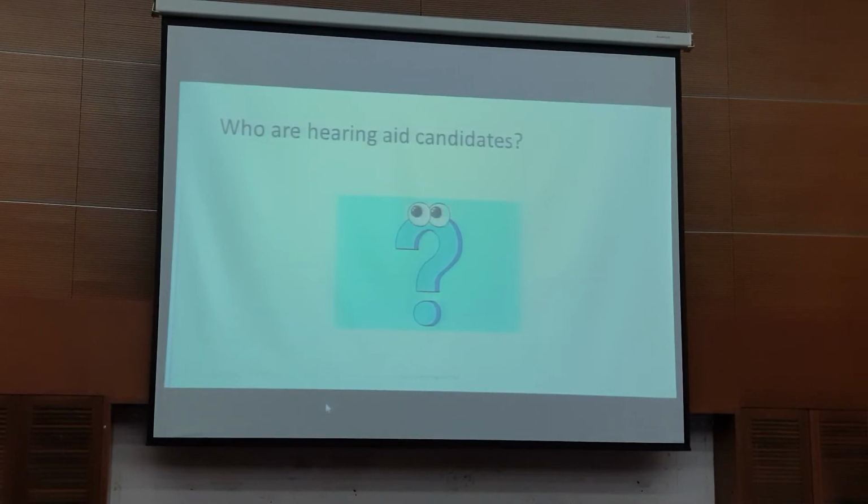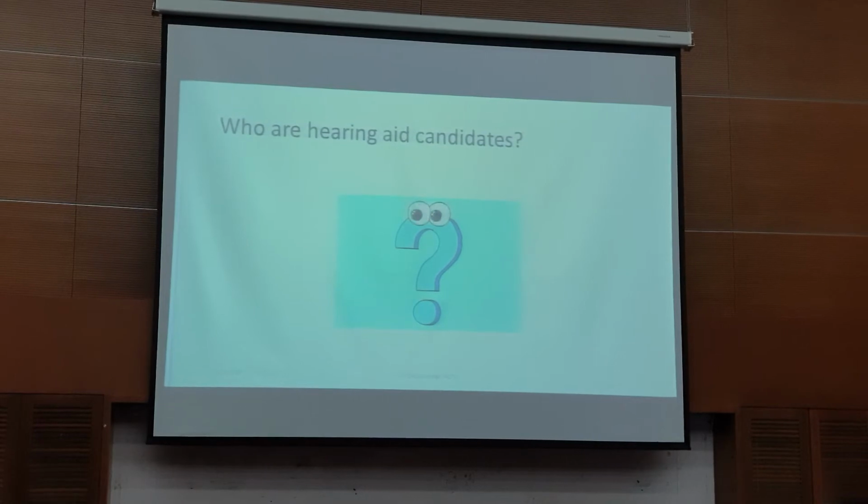Do we fit those with unilateral losses? Yes, we also do that. What's the reason and what's the purpose? Usually kalau dulu-dulu tu memang rasanya people don't bother to do anything pun, because we have seen adult cases yang just make do with one side. A profound loss on one side, and normal or near normal hearing on the other, you just cope with it.